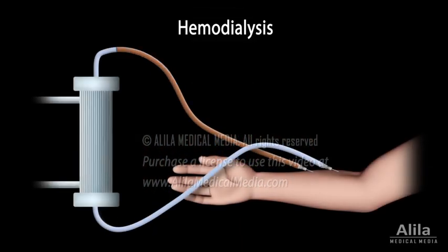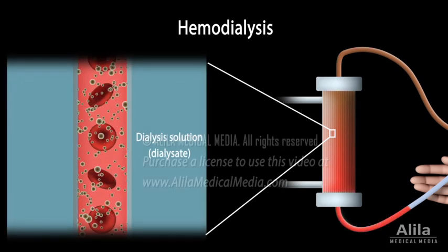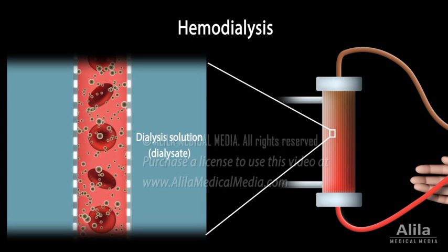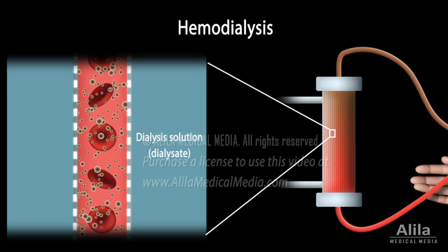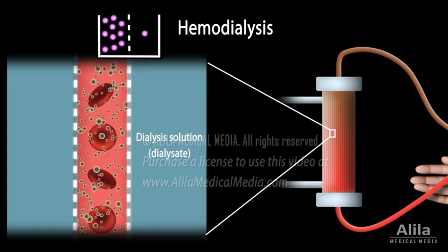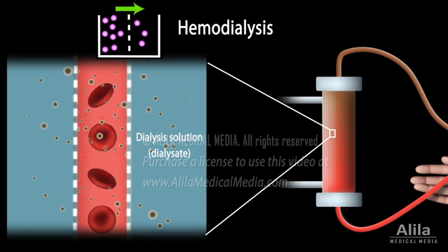Once inside the machine, blood flows within tiny tubes surrounded by a dialysis solution called dialysate. The walls of the tubes act as semi-permeable membranes that allow only small molecules, such as water, nitrogenous wastes, and electrolytes, to pass through. The filtration occurs by osmosis and diffusion, where water and solutes move from higher to lower concentration.